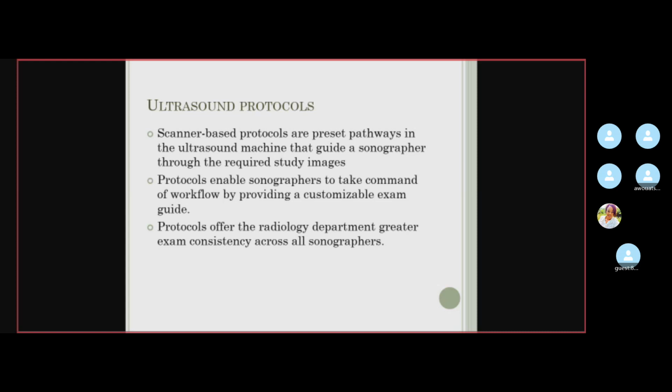The protocols will reduce our time. If we select the correct protocol, we will get good image quality without making many adjustments. But if we are doing an abdominal study and I have selected a thyroid protocol, then the image quality will decrease. So always remember to select the protocol properly based on the study.